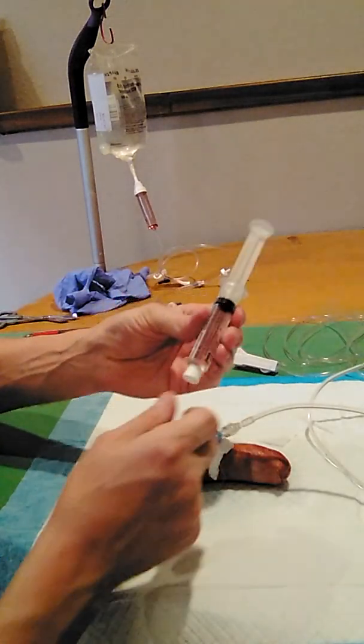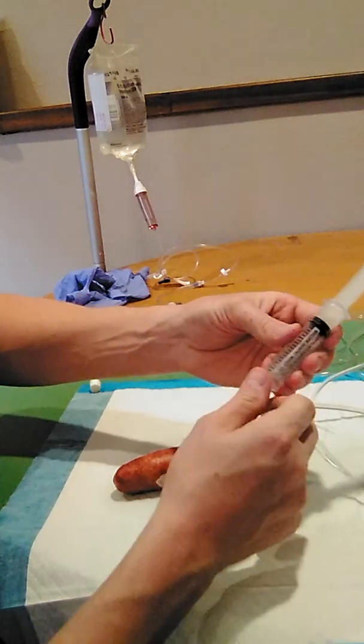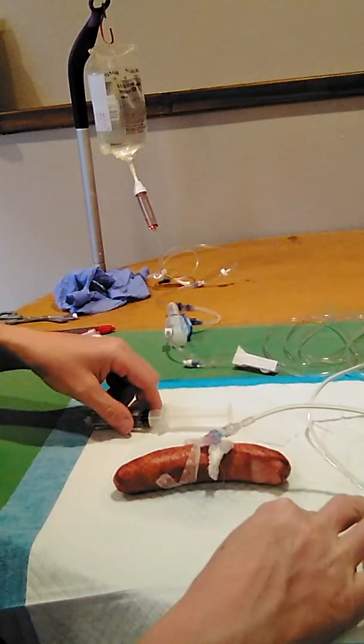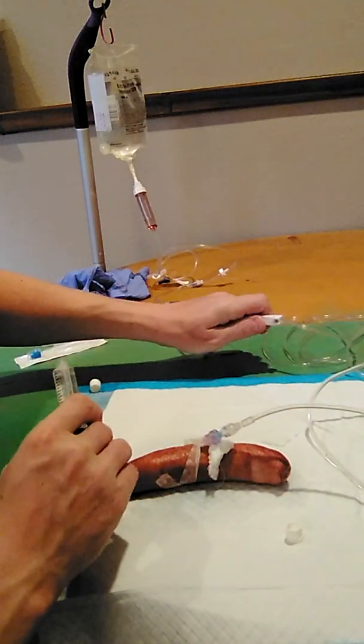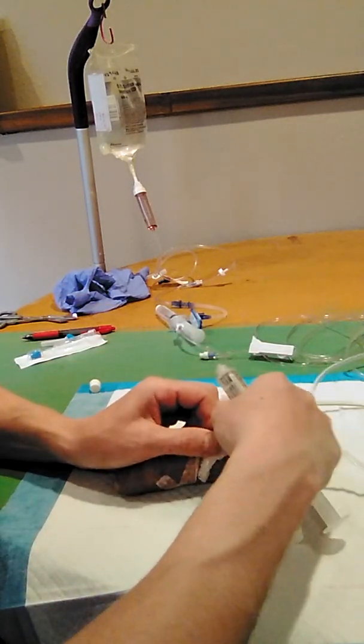So firstly, I'm going to obtain a new and clean 0.9% USP sodium chloride injection for a saline flush. So I have this locked now. I can disconnect this hub.